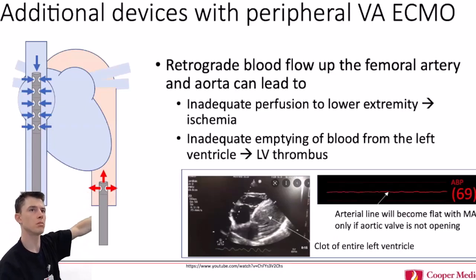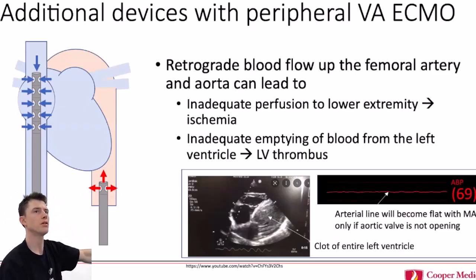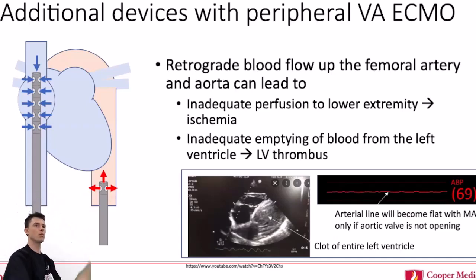There's still a little bit of blood that goes through there, but most of the blood should be drained through the ECMO circuit. So it's not your full cardiac output that you normally see coming through the left ventricle. You wouldn't need to have the Impella flow equal or higher to the ECMO in order to eject the blood.